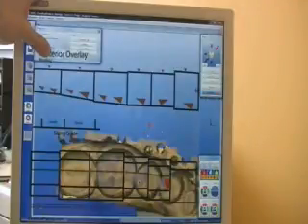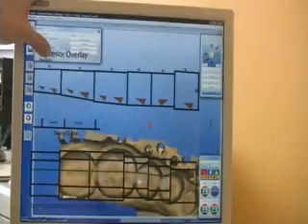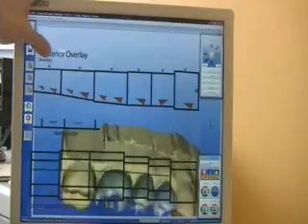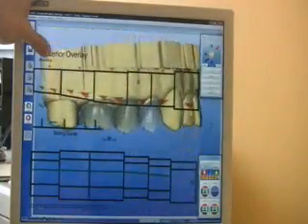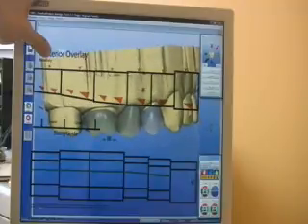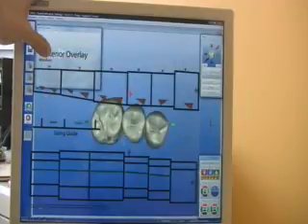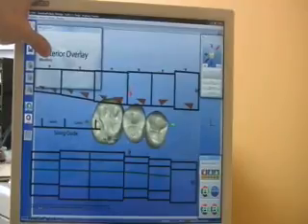So here we can see our occlusal scheme on the temporary bridge. A little more adjustment of the second bicuspid. We had a few manipulations that had to be done to fine-tune the biogeneric proposal, but as I said before, the biogeneric did a really nice job.